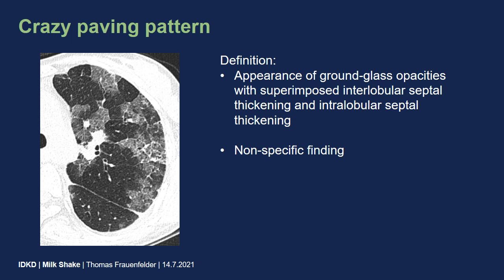The crazy paving pattern is defined as the appearance of ground glass opacities with superimposed interlobular and intralobular septal thickening, and is not a specific finding. It is restricted more to the secondary lobule level. Here you see the border of a secondary lobule — inside you have the ground glass opacities and the septal thickening, but just adjacent there is a totally normal secondary lobule, as you can see here with the central dot.